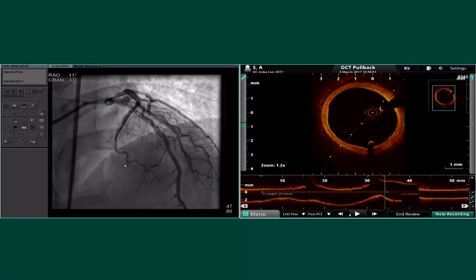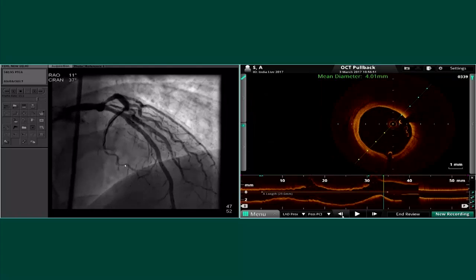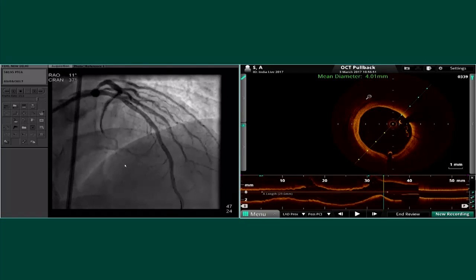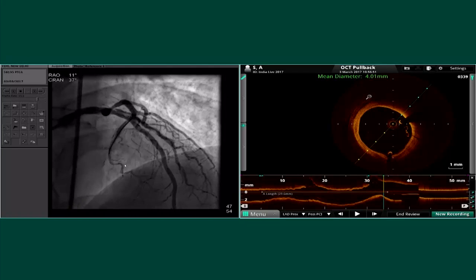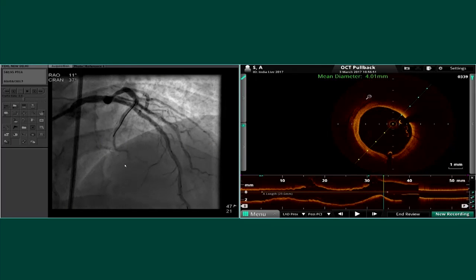So I'm going to now take a 4 millimeter and oppose these struts, and then show you whether it looks good. And I'm going to go up slowly on that 4, but go up to 20 atmospheres and oppose those struts. Well, you do the 4 atmosphere, the 4. What do you say? Millimeter.